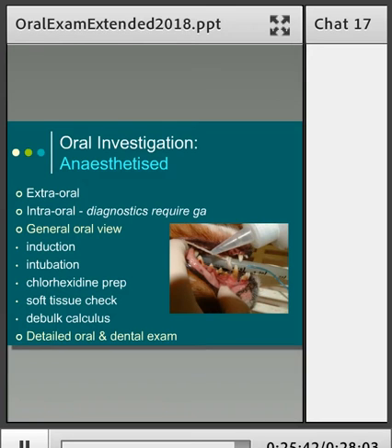And it's down to looking at soft tissues. It sounds very simple, it is, but it's vital that you do it, otherwise you're going to miss things. So underneath of lips, inside cheeks, palate, tongue, and importantly the undersurface, the ventral surface of the tongue, and the floor of the mouth. You may find that you can't see the teeth because there's so much calculus.